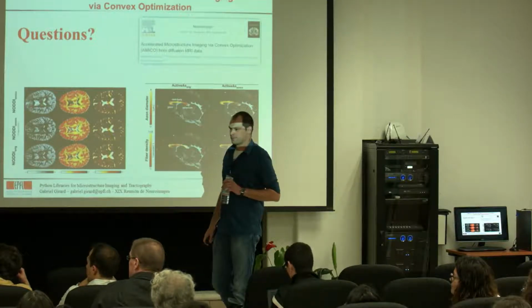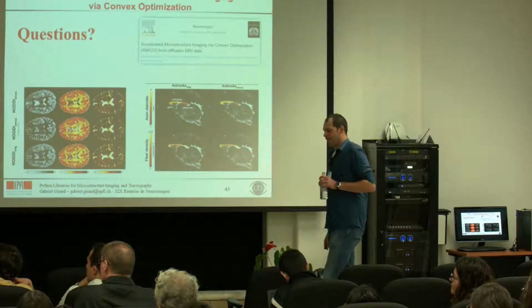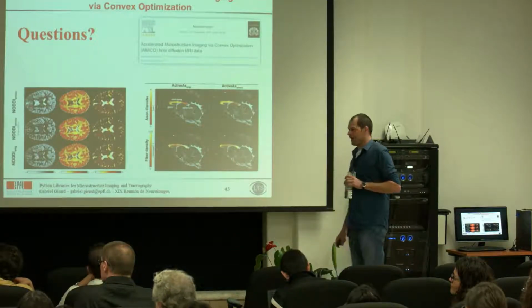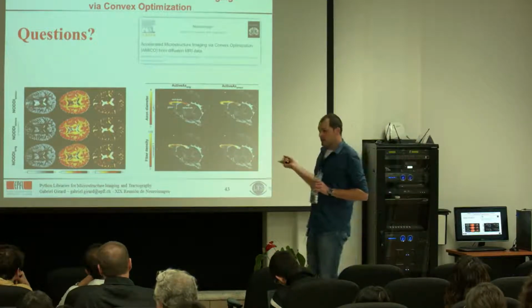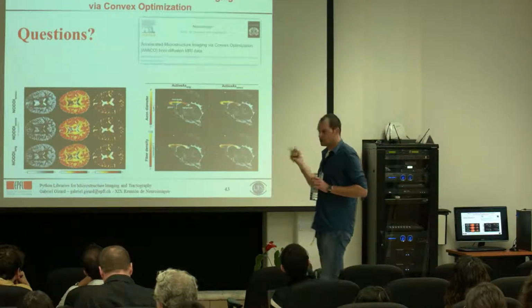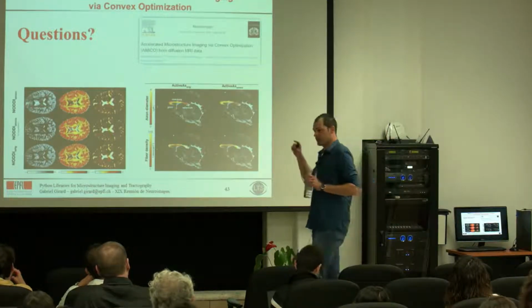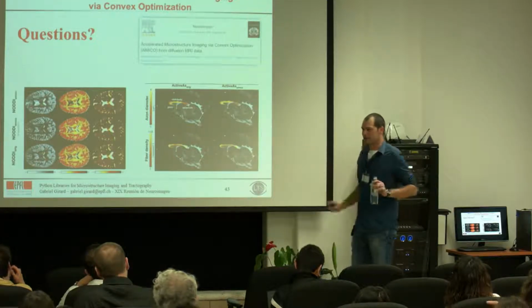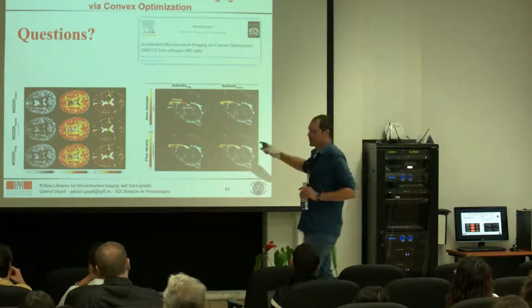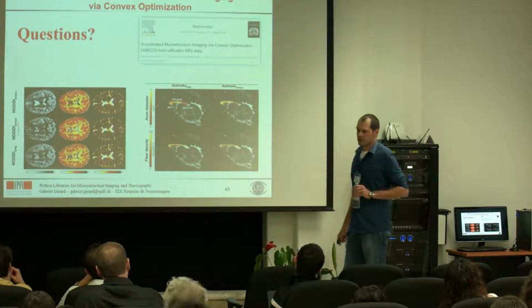Amico was first developed for MATLAB, and that's the one I had used. Is it still maintained, or has everything been translated to Python? Yeah, the MATLAB version is not maintained anymore. It is on the GitHub. So if you want to do the experiment of the original paper with the same implementation, everything is there, but it's fixed in time. If you want to develop it, it's up to you. The code is there. But the Python version is faster, and there was a bit of refactoring, so it's easier to use as well.